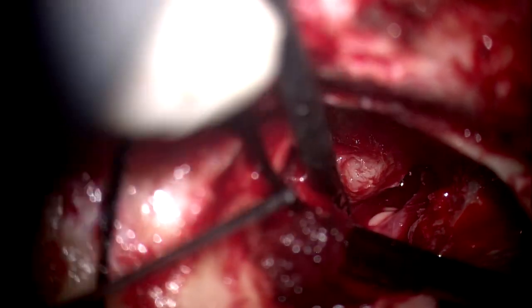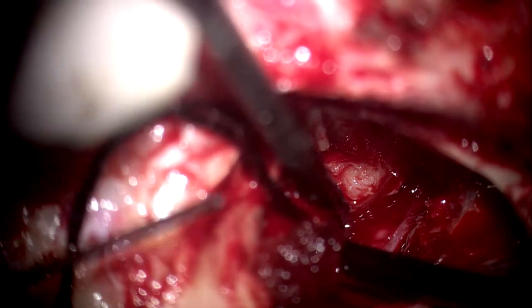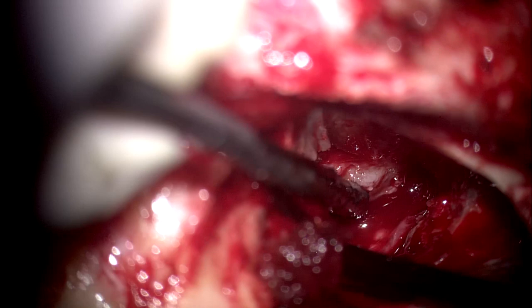Hello? Yes, sir. Can you see some venous bleeding? We can see some oozing, yes. I don't understand where it has all of a sudden started. Anyway, I compressed. There it is. Give me one more. Make it long. Yeah, I can see deeper down some ooze.